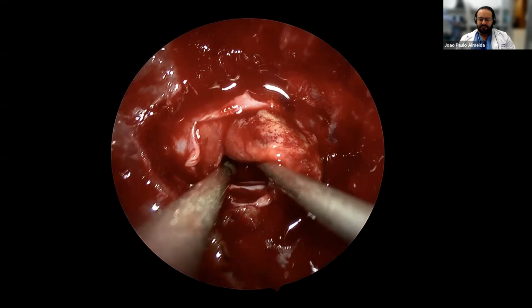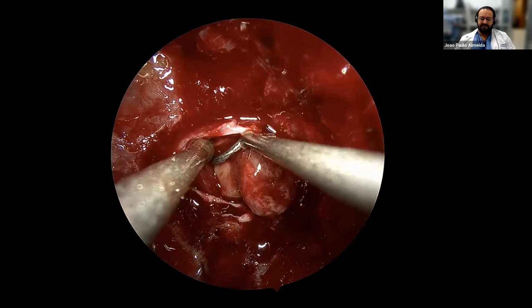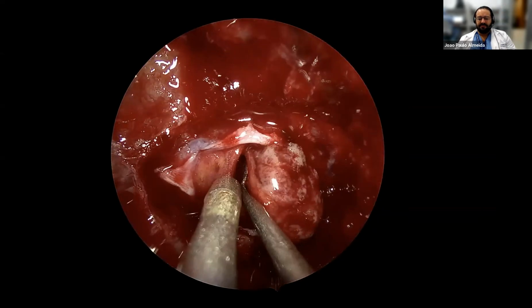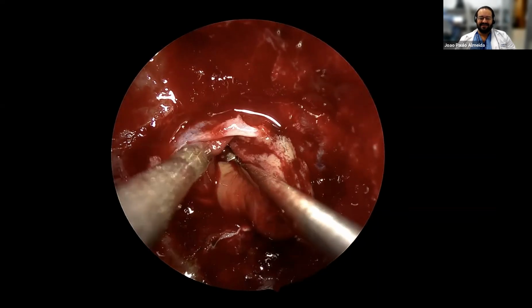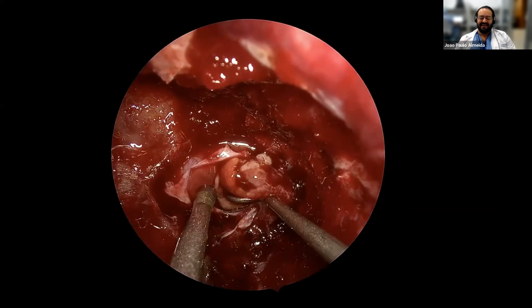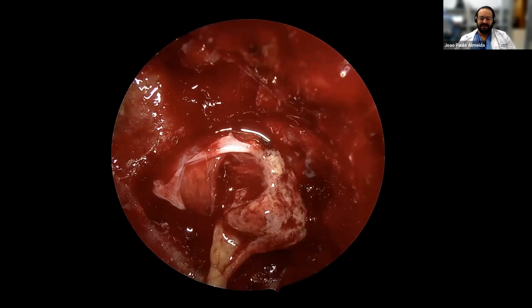So we went ahead and we mobilize the tumor. You see that the tumor is slowly kind of breaking from inside out, and that's fine. You just kind of need to preserve the planes. Take your time. I like this called the hockey stick to celebrate our Canadian hockey players, and then here we got the round knife to keep dissecting that.